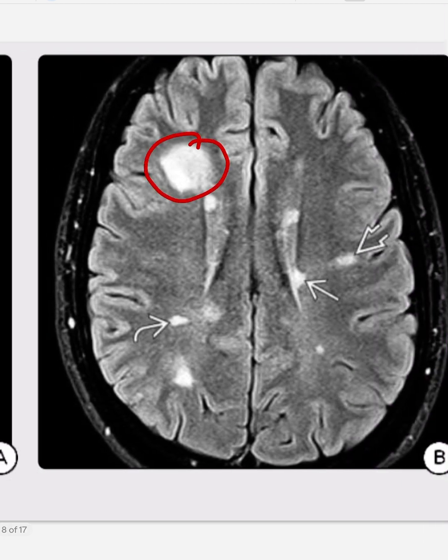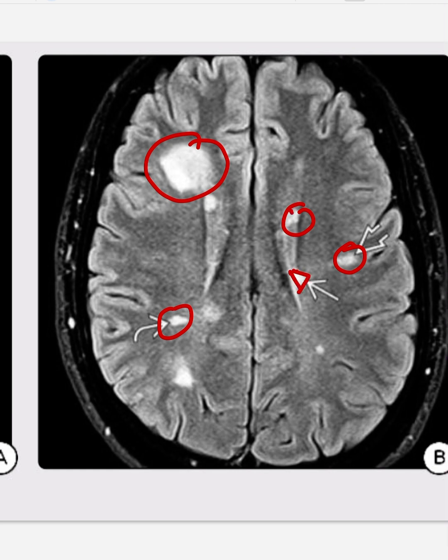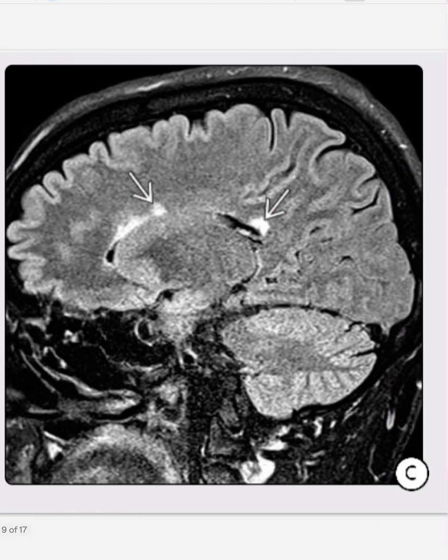On FLAIR in the same case, multiple round and ovoid hyperintensities are present, which are triangular-shaped and perpendicular to the ventricles, following the course of the deep medullary veins. The sagittal FLAIR image in the same case demonstrates the triangular shape of the periventricular lesions with irregular ring enhancement seen in some but not all lesions.